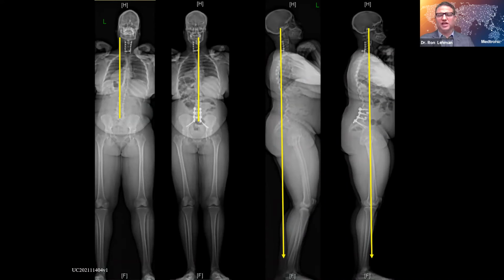And so many surgeons will say, well, yeah, that's great, Dr. Lehman, but you just did a 2-level surgery. It's not really a deformity operation. But I would actually probably reword that and say this really is a deformity operation, because by doing a good job of realigning the spine, really in the sagittal plane, you can see now her legs are completely straight, her knees are straight, she's not extending her hips. Her gravity line in terms of her skull goes right through her femoral heads, right through her knees. And hopefully this lady now ends up not with a much larger surgery to help correct this.